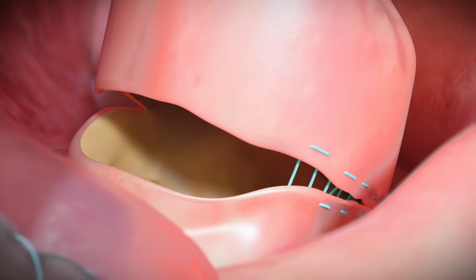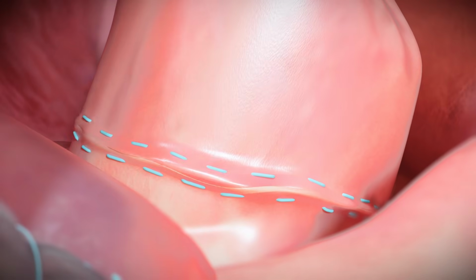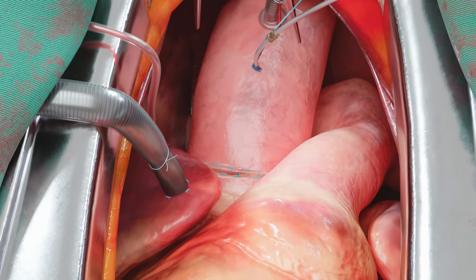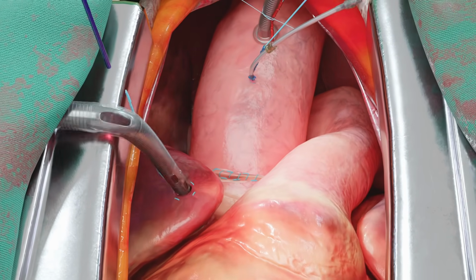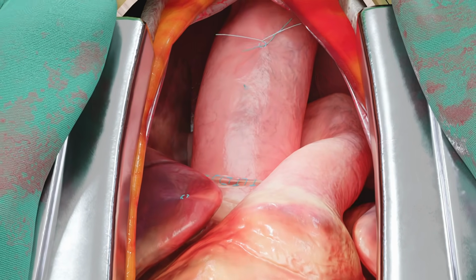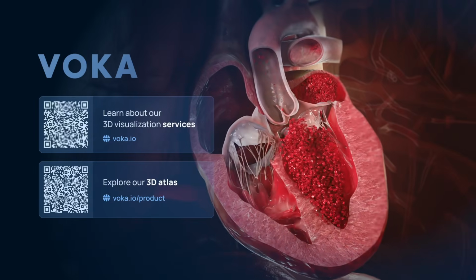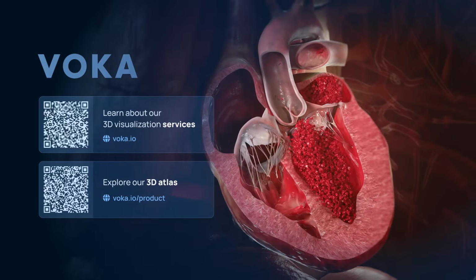This markedly relieves symptoms such as dyspnea, rapid fatigue, and other manifestations of heart failure. The use of autologous pericardium generally eliminates the need for lifelong anticoagulation and reduces the risk of thromboembolic events and bleeding, further improving the patient's quality of life and long-term prognosis.